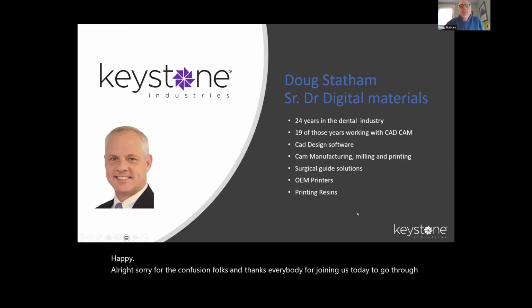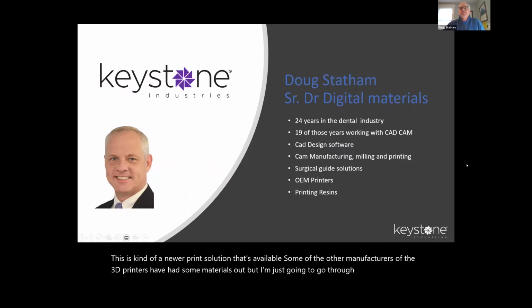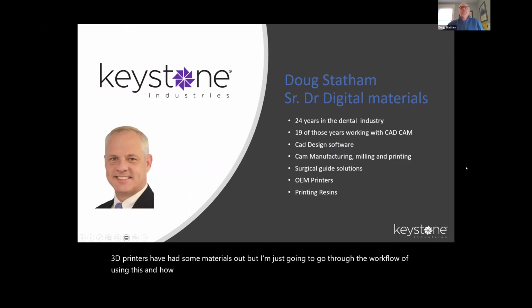This is a newer print solution that's available. Some of the other manufacturers of 3D printers have had some materials out, but I'm just going to go through the workflow of using this and how to incorporate it into your business. First, I'm going to give you a little information about Keystone.